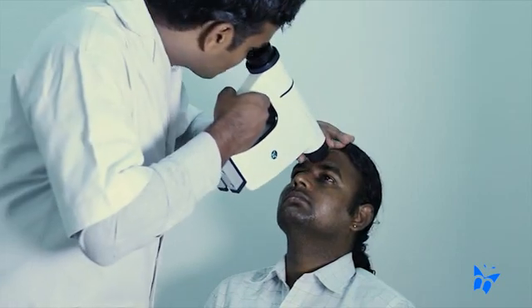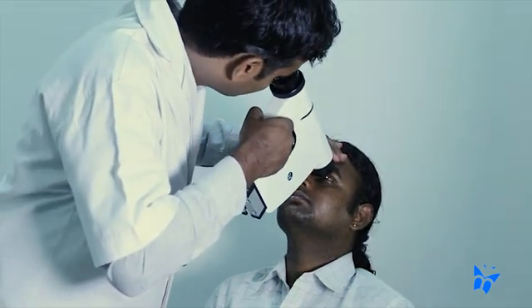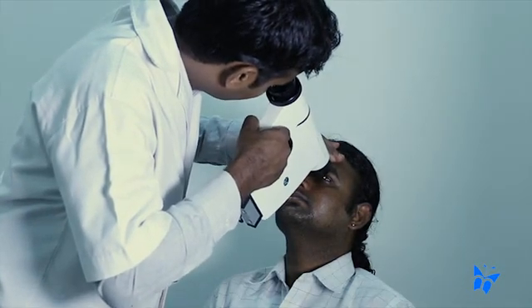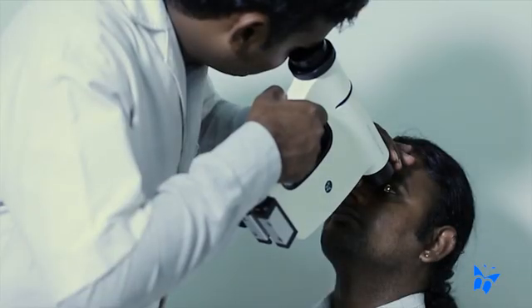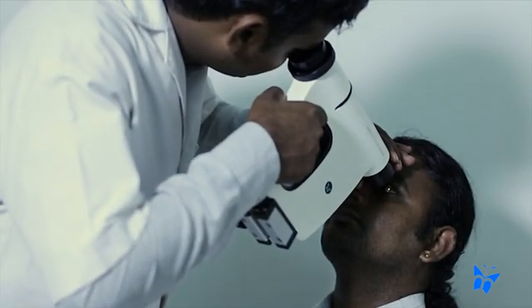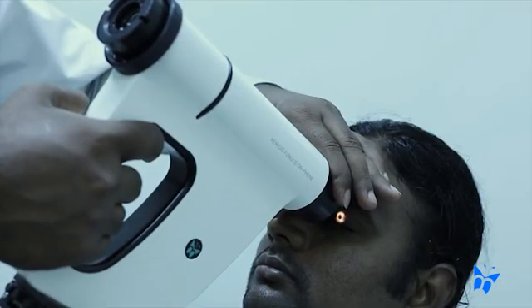FOP can be used as a direct ophthalmoscope without the universal phone holder. The use of annular illumination design ensures a high-quality view of the retina with minimal reflex artifacts. Hold the ophthalmoscope at the right working distance as determined by the formation of an annular ring on the cornea.